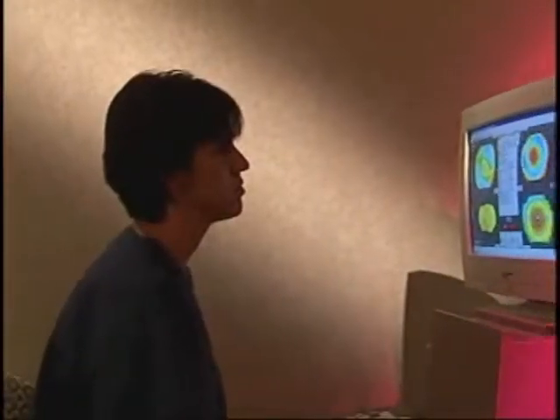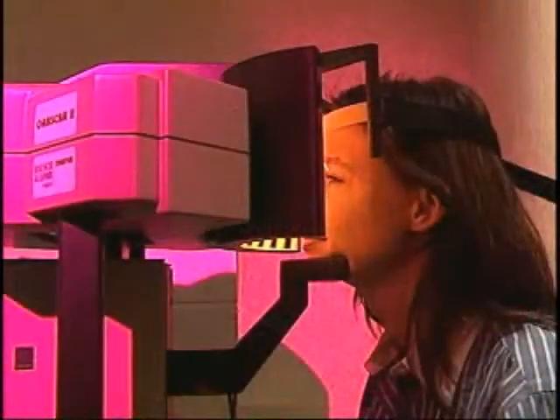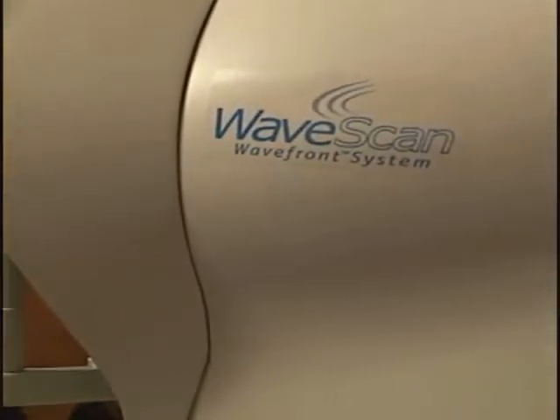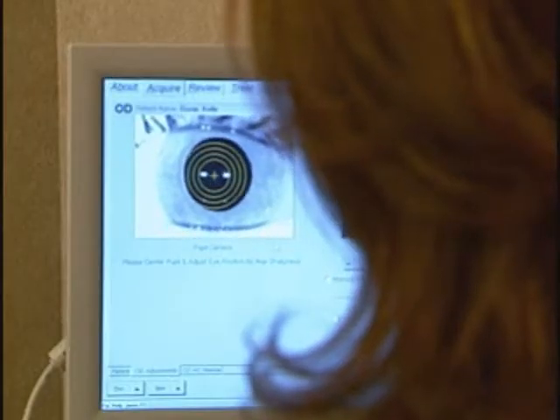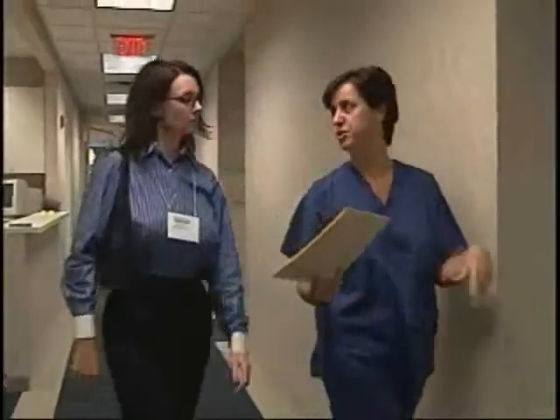Following check-in, if it has not been accomplished on a previous visit to the center, 2 sophisticated color images called orb scans and wavefront analysis or aberrometry and any final preoperative measurements will be performed. Your eye care professional or one of our technicians will then escort you to the pre-op area. It is at this time that you will meet your surgeon and discuss any remaining questions that you have regarding the procedure. You will then be escorted to the laser suite where you will spend approximately 10 minutes.